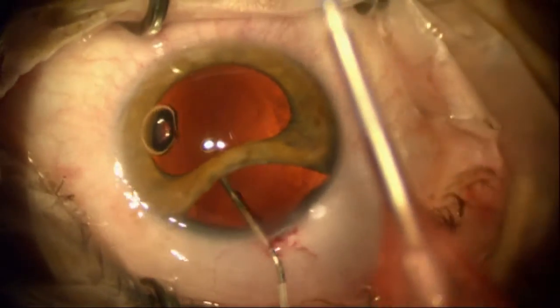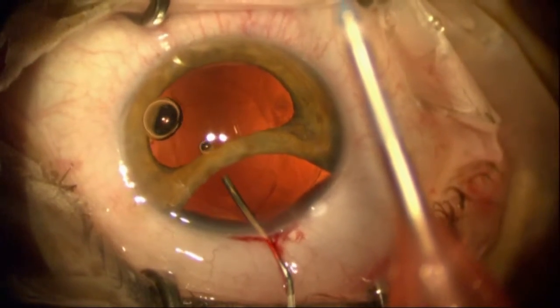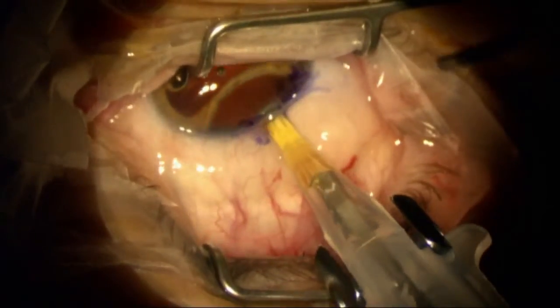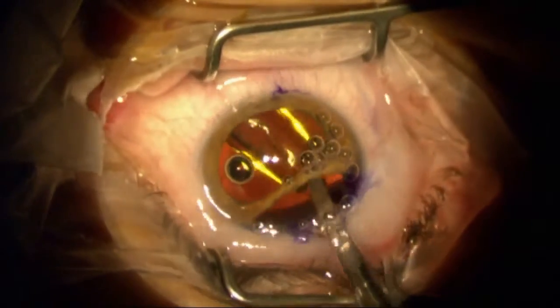Next I'll open up the capsular bag with a cohesive viscoelastic, and I'll insert a toric intraocular lens into position and properly orient that lens.